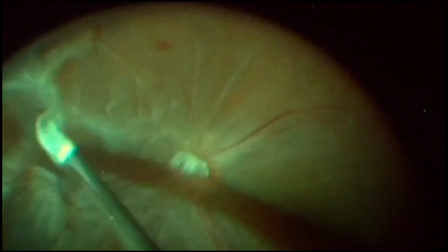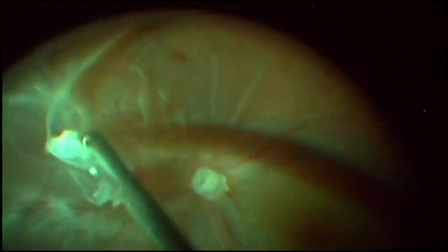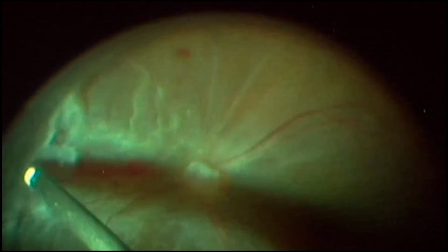Whereas in case of CRD, the detached retina makes the dissection difficult. This case highlights membrane dissection using the cutter alone. Care, however, should be taken to identify the areas of firm adhesion so as to prevent iatrogenic breaks and further intraoperative complications.